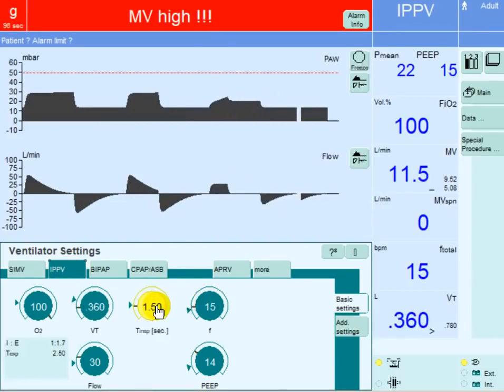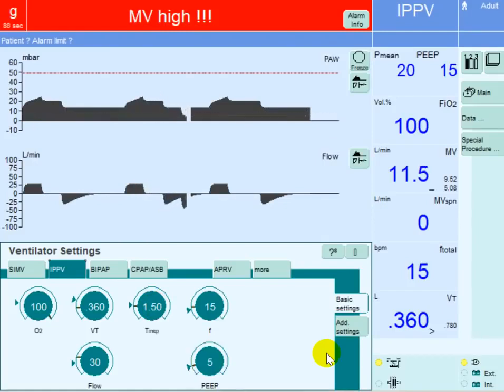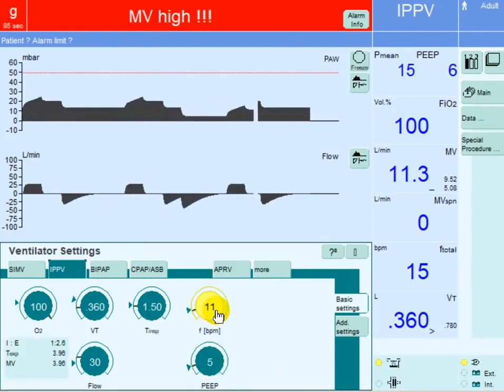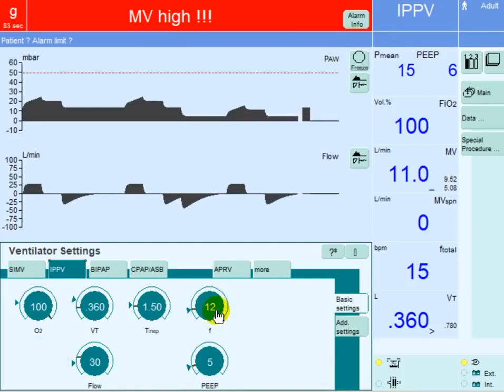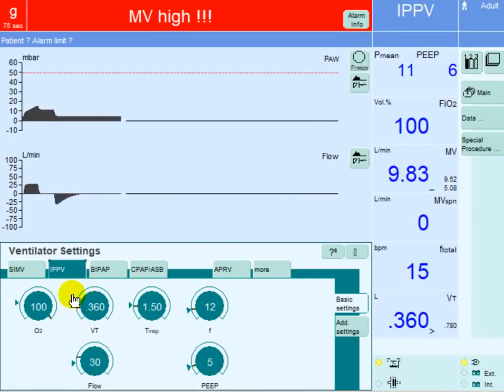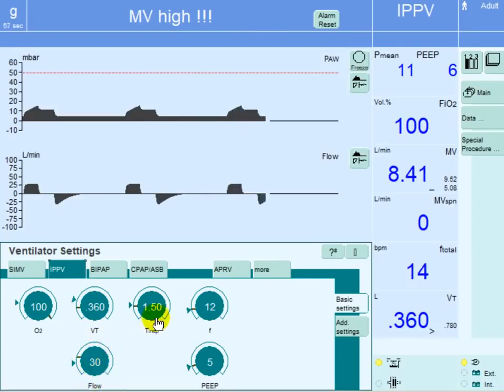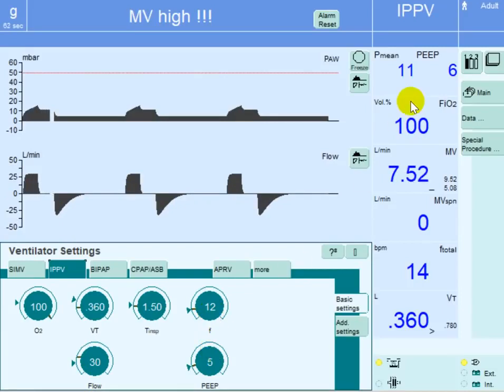In volume control mode of ventilation, things are similar except for the inspiratory pressure, as we cannot control it directly. This is the same patient back to original settings but in volume control mode with a tidal volume of 360 ml, FiO2 at 100 percent, flow rate of 30, inspiratory time of 1.5, respiratory rate of 12, and PEEP of 5. The mean airway pressure is back to 11 centimeters of water.